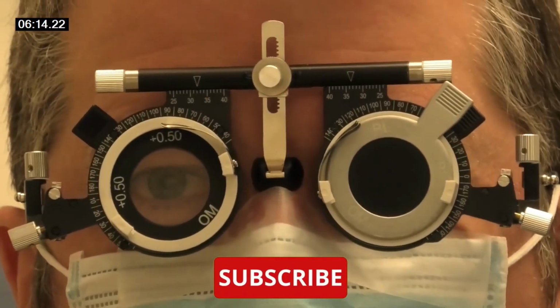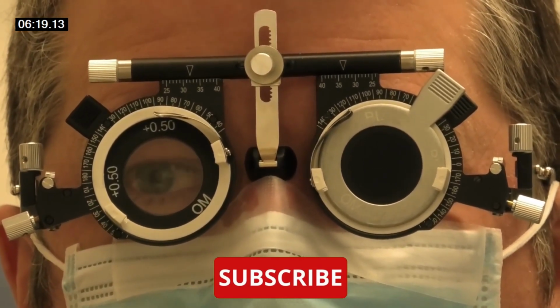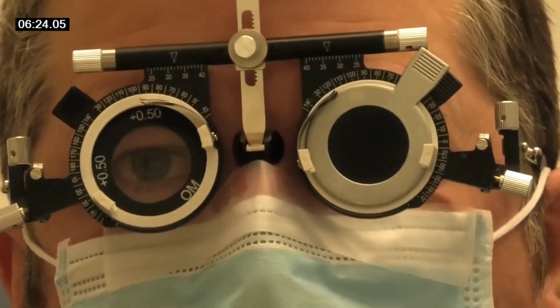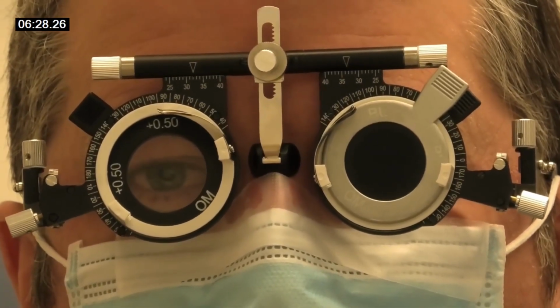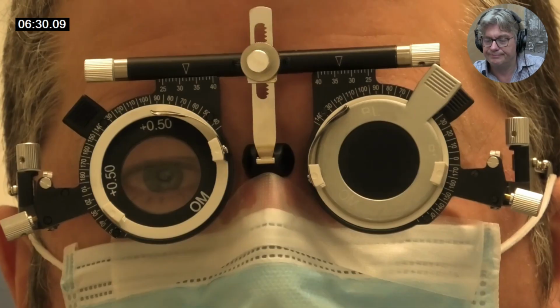Okay. Alright, so when we change the plus lenses with people like this, because they can accommodate, because you're 41, did you say? Correct. So we have to be a bit cautious about that, don't we? Yeah. So here we go now. That's good. So obviously with these things, you often get better and better at shuffling the plus lenses. But sometimes when I'm doing it, I actually just change them really quickly, and that is just as good as long as you change them really, really quickly.